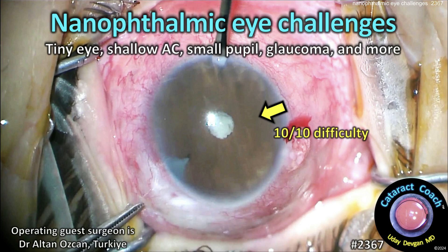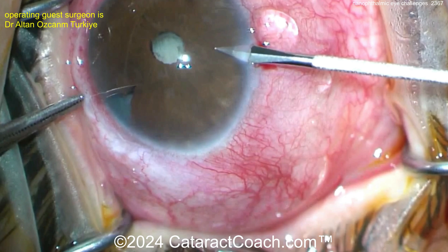Cataractcoach.com — nanophthalmic eye challenges: a tiny eye, shallow anterior chamber, small pupil, glaucoma, and more. Truly 10 out of 10 difficulty.